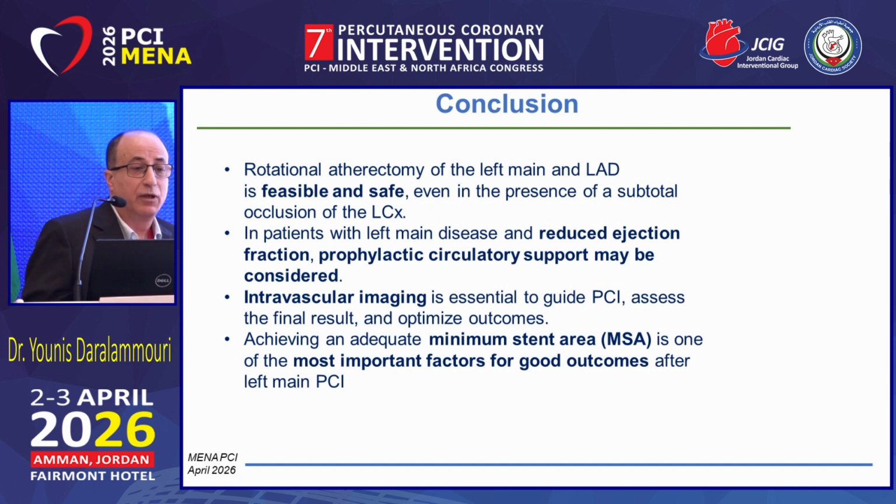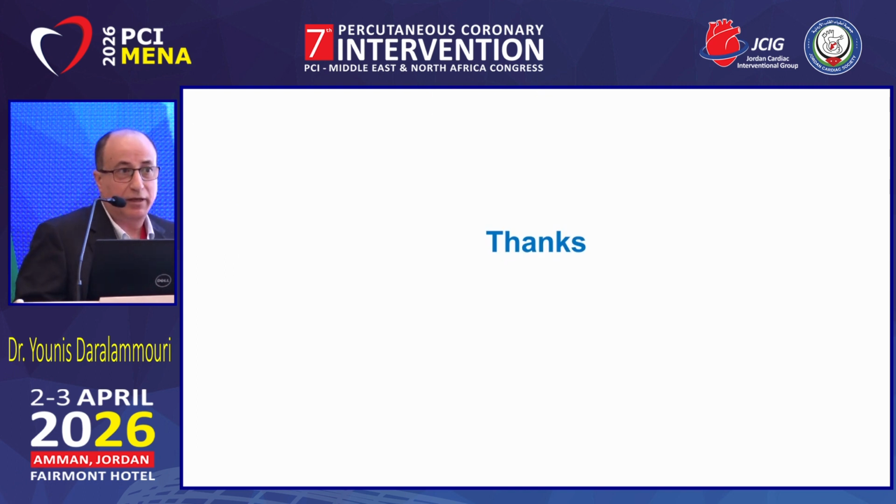In conclusion, rotational atherectomy for left main and LAD is feasible and safe even in the presence of subtotal occlusion of circumflex. In patients with left main disease and a reduced ejection fraction, prophylactic circulatory support may be considered. Intravascular imaging is essential to guide PCI, assess the final result, and optimize outcomes. Achieving an adequate minimal stent area is one of the most important factors for good outcomes after left main PCI. Thanks.